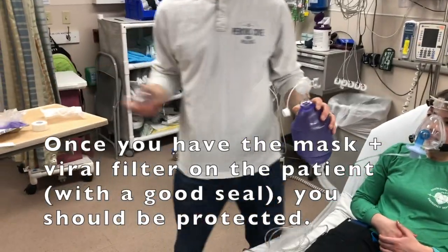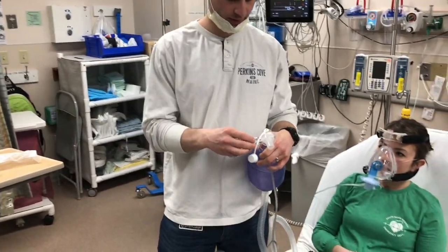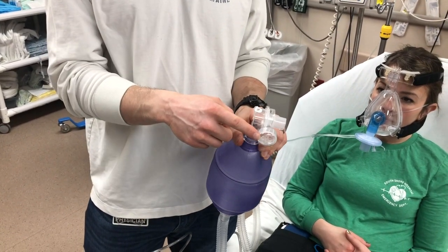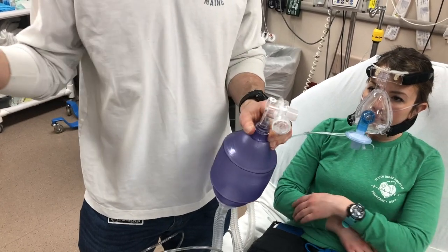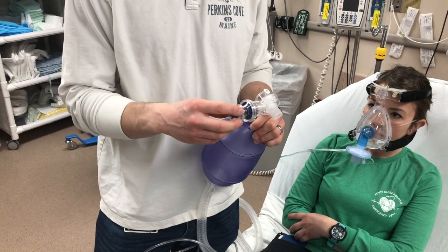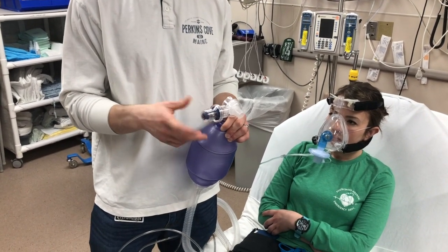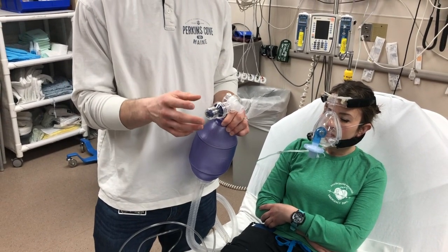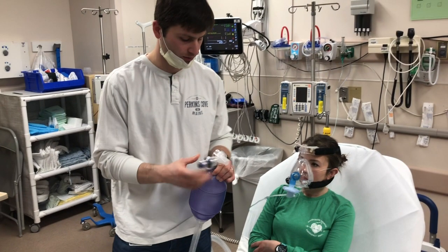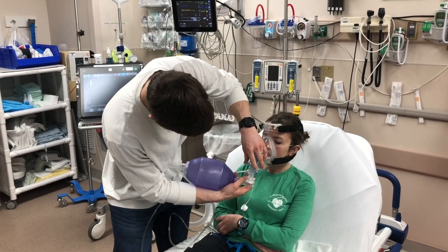Then you're going to take your BVM and your peep valve. This cap that comes on the BVM standard needs to come off and be replaced with a peep valve. What the peep valve does is when the patient takes a breath in, it causes them to get more of their air from the BVM — which is in turn hooked up to high-flow oxygen — and get less of their air from the room. It can make it a little bit hard for the patient to exhale if you crank it up too high, so start on the lowest setting, which is 5. If you're having a hard time oxygenating but they don't seem to be having issues exhaling, you can turn the peep up. Then connect this to the bottom side of the viral filter.